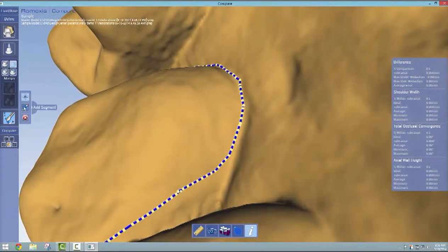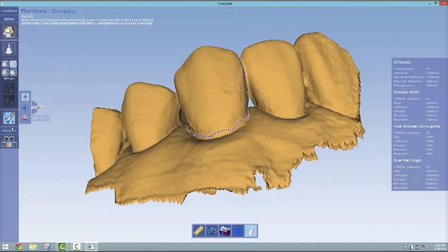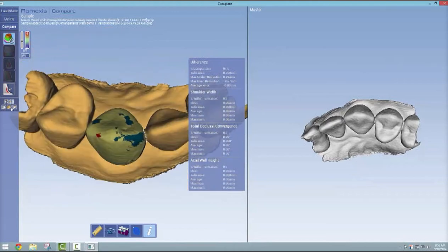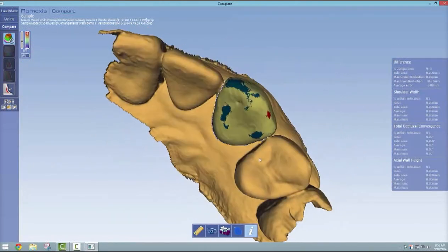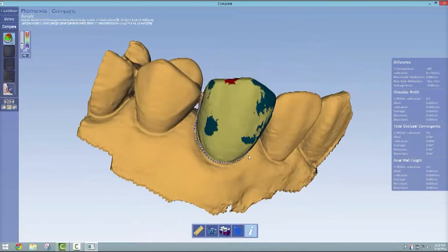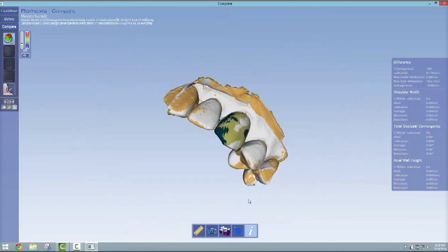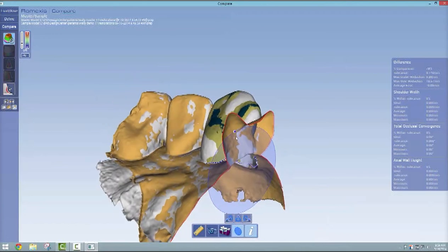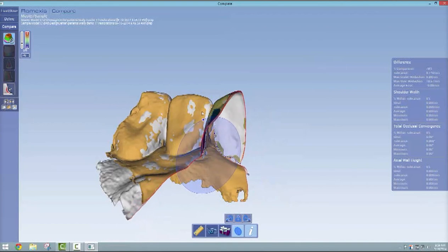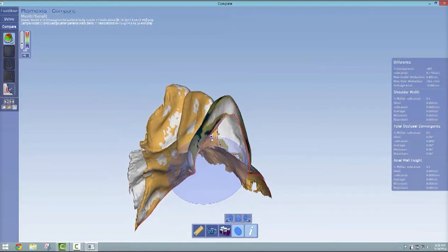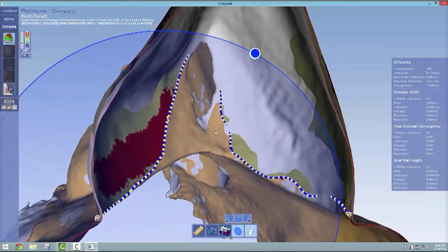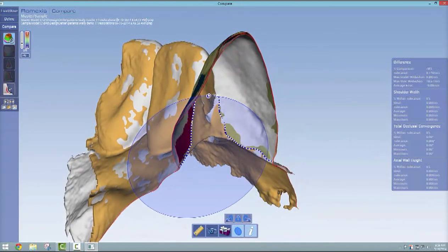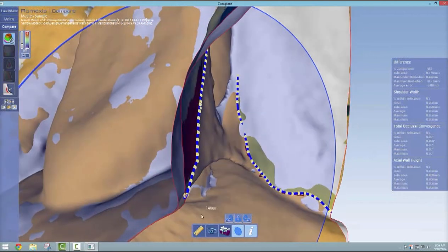We're ready for compare. Just click the compare tab. I like to make my model bigger by hitting the center icon down there. You should notice that only colors showing are inside that lasso line that you drew. Likewise, you can superimpose the master and then slice it just to verify colors are correct and defects are correct.